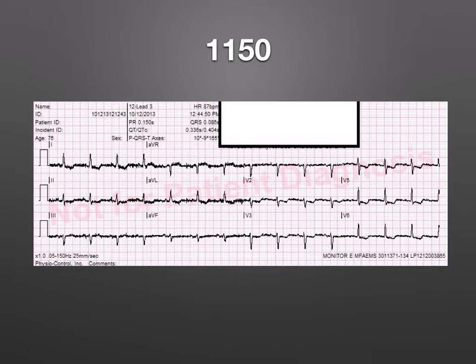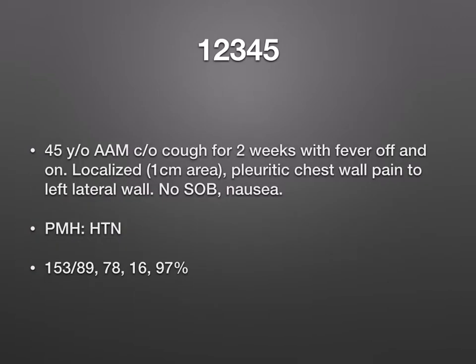Now, again, we're not seeing any elevation, but we actually see more depression. So, again, a concerning situation for ACS. Perhaps it is unstable angina, or perhaps it's a non-ST segment elevation MI, but it is not an ST segment elevation MI.